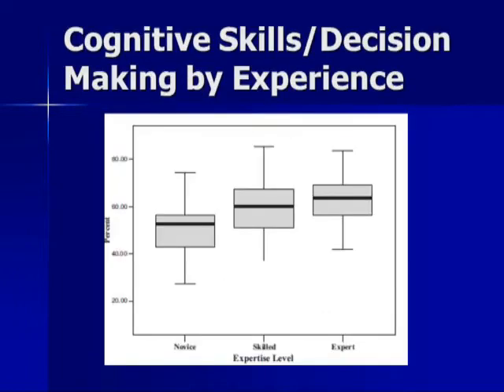And these were already shown, so I think the one thing that is important is that simulation training, particularly for interventional cardiology, is not just about the haptics, not just about catheter navigation. And I really think de-emphasizing this whole thing of how long did it take you. I don't want the cardiologist who does this in 1 minute. Things that are at the extremes, the fastest or the slowest, are probably not where you want. There's probably a sweet spot in the middle there.